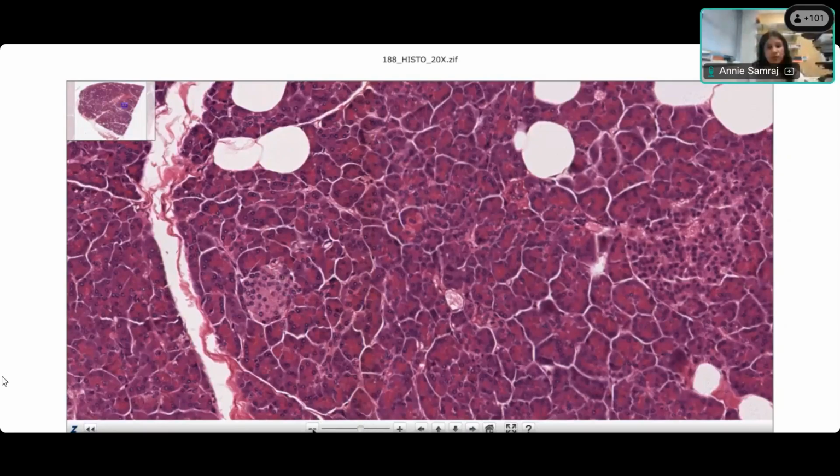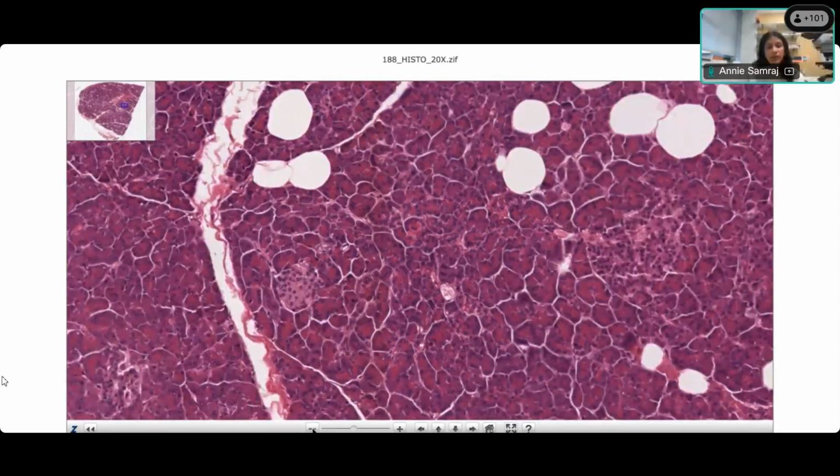And sometimes you also see, particularly in chronic pancreatitis, when you have lots of acinar atrophy, or when you have a relative hyperplasia of the neuroendocrine cells, sometimes you can see just cords and strings or trabeculae of these neuroendocrine cells. So that is what we call diffuse arrangement.